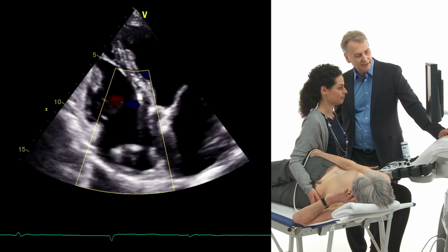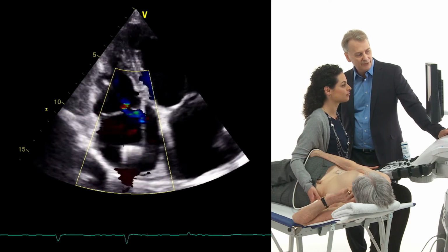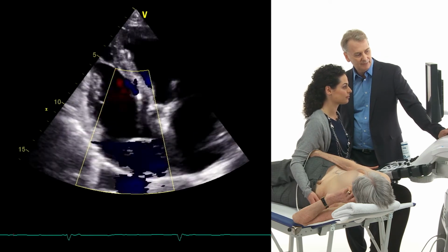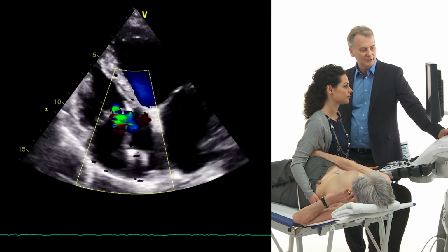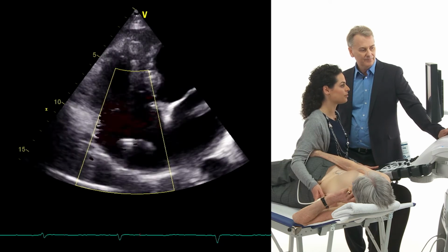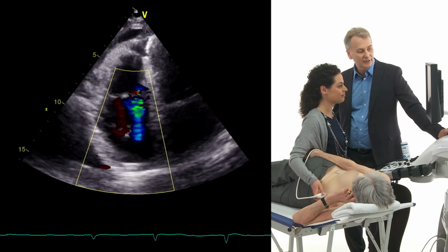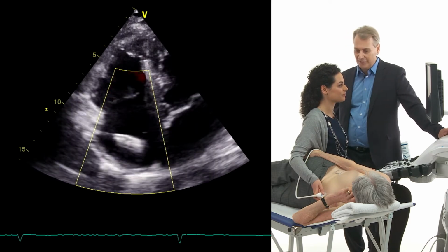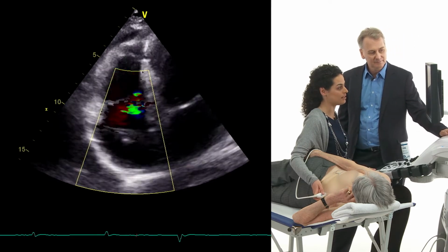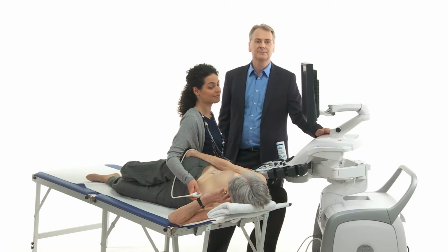very similar to the mitral valve. It looks like the jet sprays a little bit, but you focus on the proximal portions. Maybe try to image from an intercostal space further up or down. Usually it's a good trick to get the widest jet. You see it. This is a very good trick. And looking at all these images, how severe do you think TR is? We can say it's at least moderate to severe. I would agree completely.